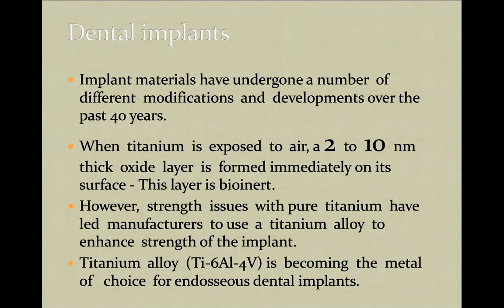Well, one of the things that will be discussed in the lecture, but just a few words. One of the most important things to take into account when you'd like to create a dental implant is that your implant should be absolutely bioinert to the body. There should not be any devastating reactions between the dental implants and the bone. This is the only way to achieve good stability for a long period of time.